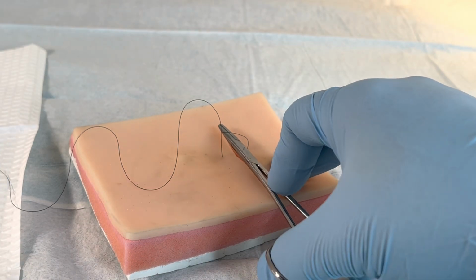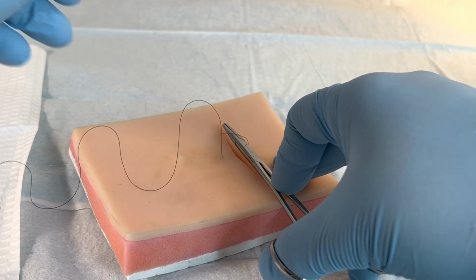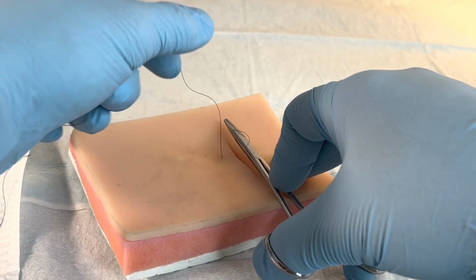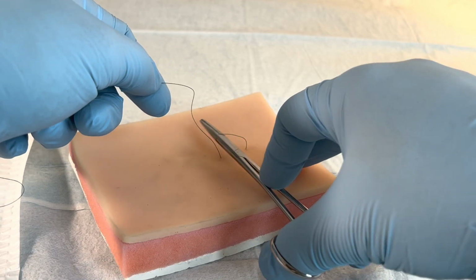Will not be using my pickups for this. The needle is loose, so unless I were to grab it actively, it's not a risk for sharp at this point. I mean, we're still aware of it. It is still a risk, but we are being mindful, and this is an appropriate way to do an instrument tie. So I grasp the lead edge.